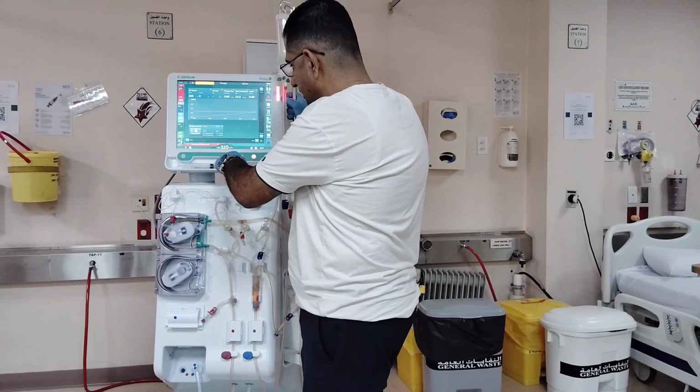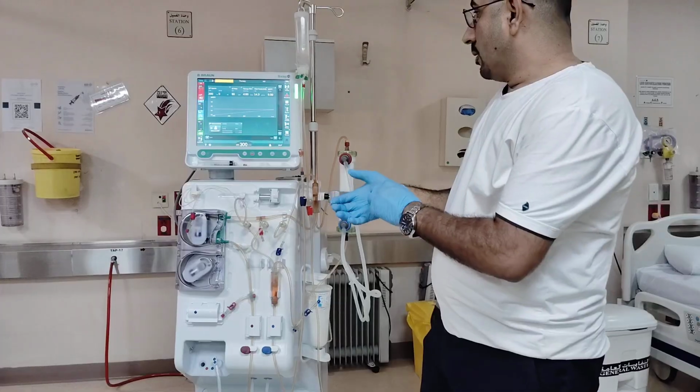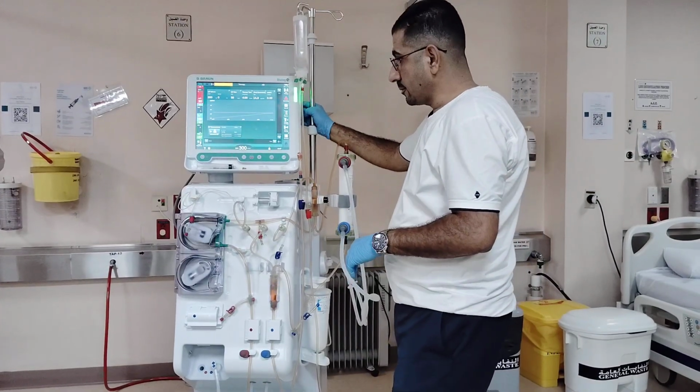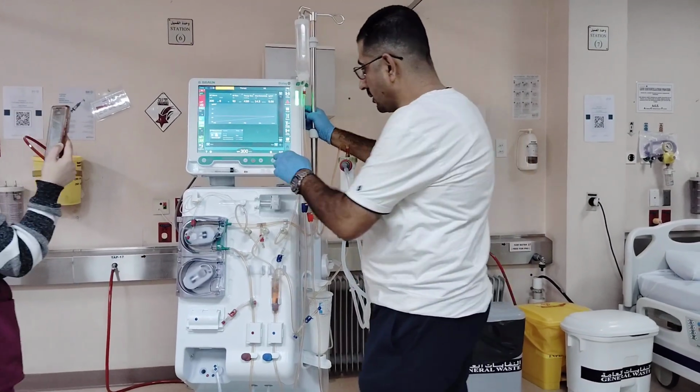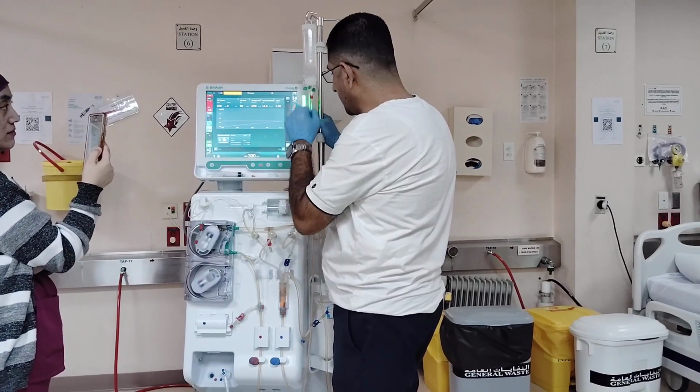The green color is the pressure for TMP. Arterial, venous, TMP, the green. So now the artery is straight, and you can check.